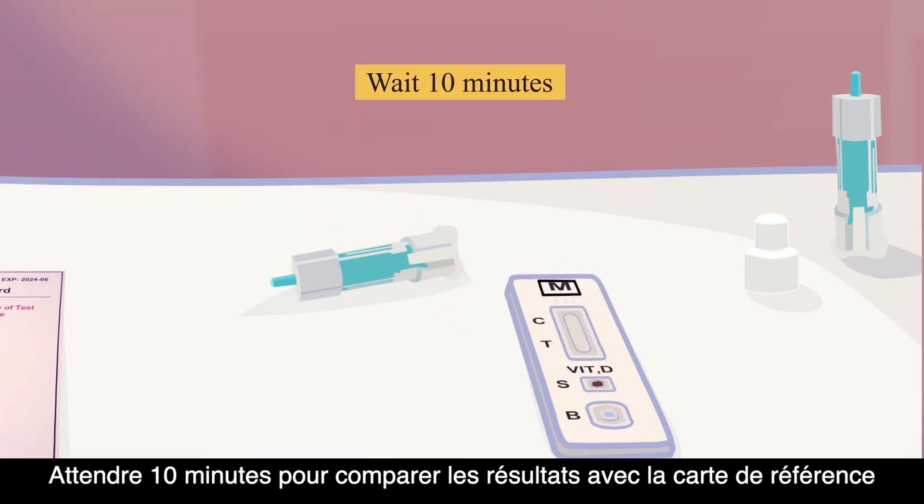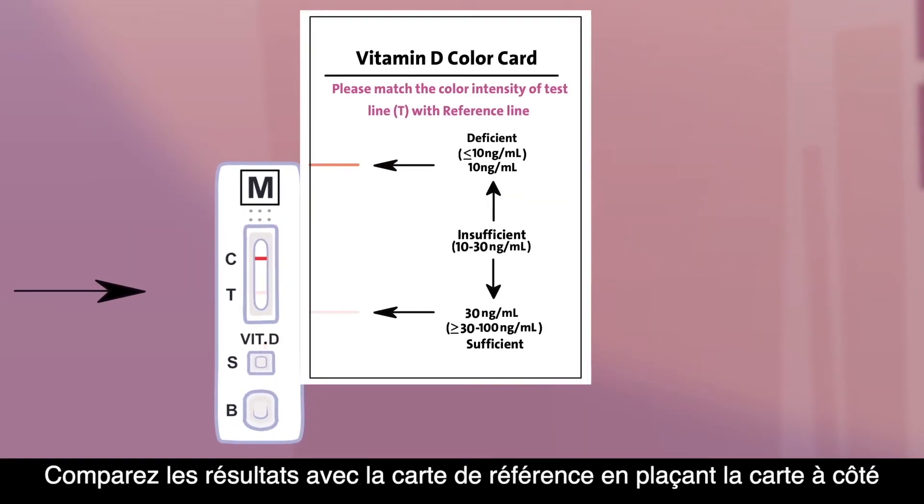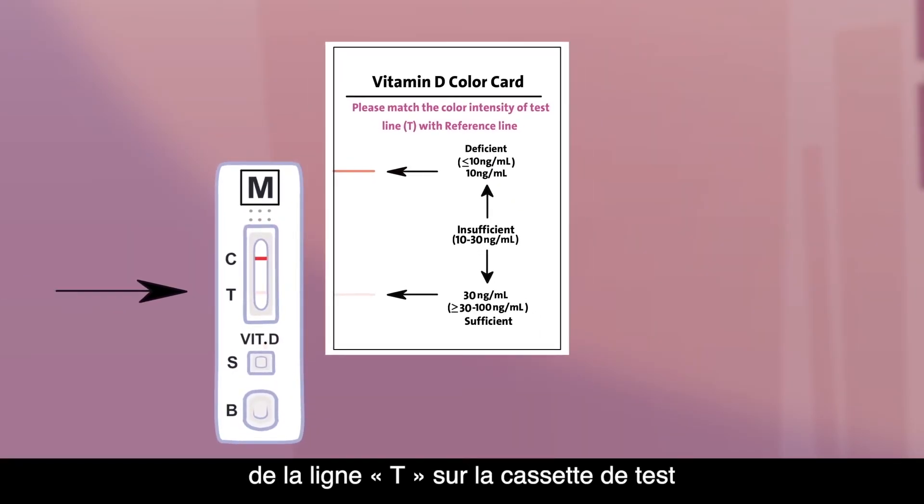Wait 10 minutes to compare the results with the reference card. Find your results by placing the reference card next to the T line on the test cassette.